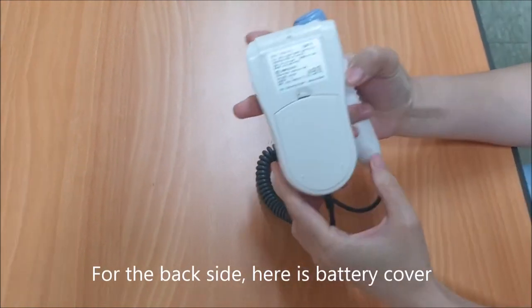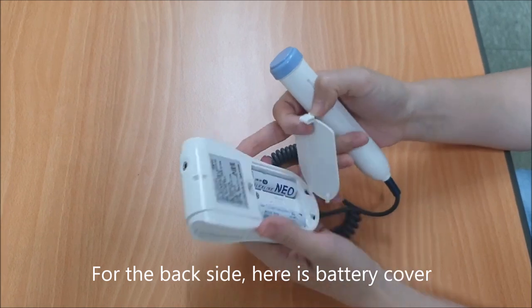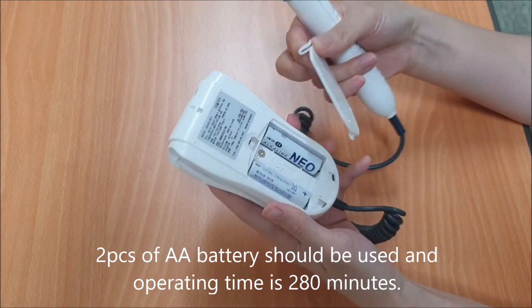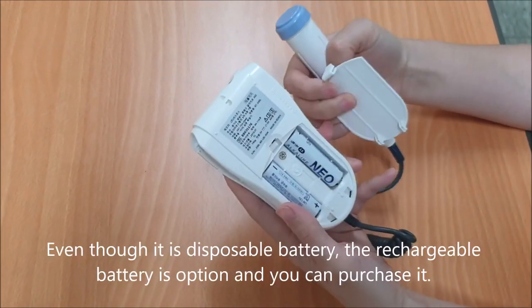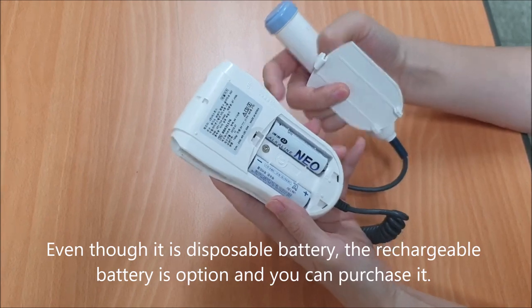For the back side, here is the battery cover. Two AA batteries should be used and the operating time is 5 hours. Even though it uses disposable batteries, a rechargeable battery is an option that you can purchase.